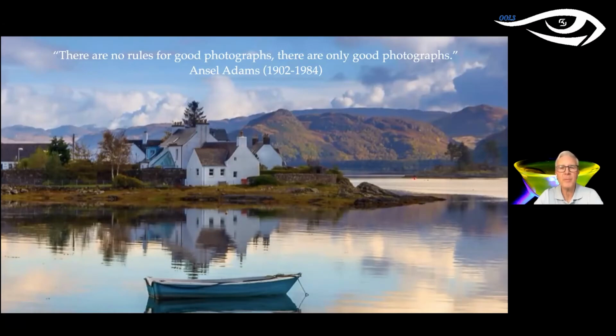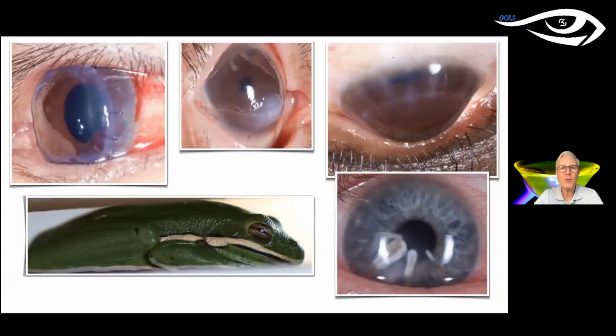The famous American photographer Ansel Adams stated, "There's no rules for good photographs. There are only good photographs." And so maybe I'll help share some ideas with you. How do you make that better? We see a variety of conditions in the office, and we certainly want to document that for our own learning, and also to share this with other doctors that we may seek their help, or maybe laboratories who would be designing lenses for us. So just a few examples here.